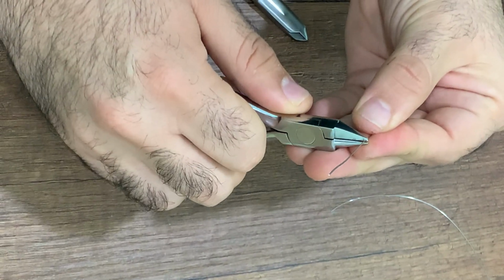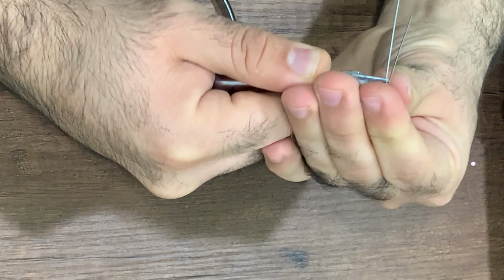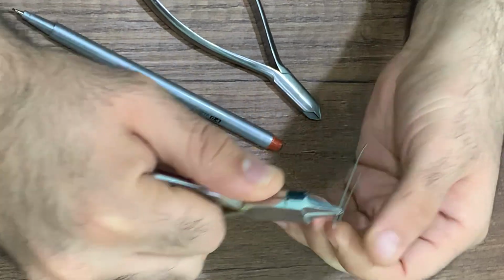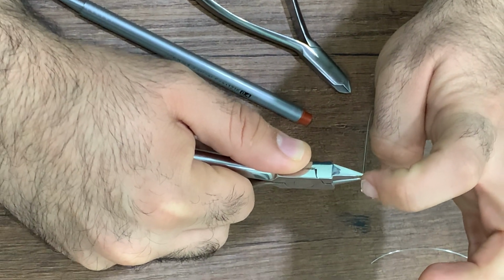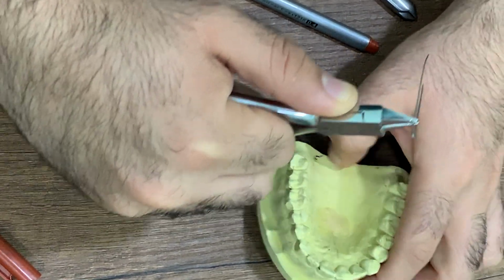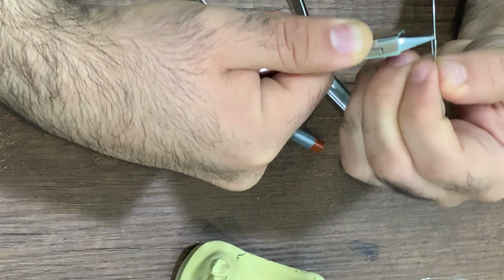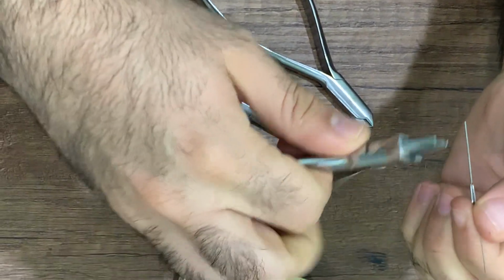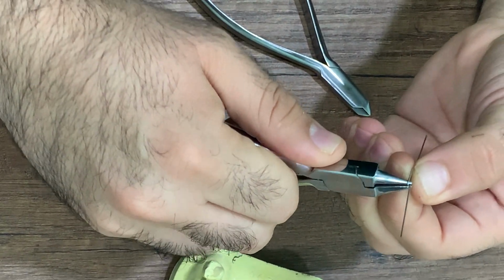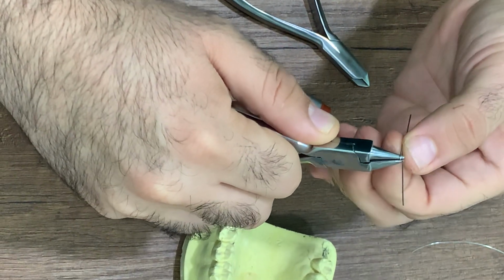Firstly, we start to make the horizontal arm with U-loops. Like this. We select the width of the horizontal arm on the tooth to be moved, like this. And we bend the wire. And the vertical arms start at right angle to the U-loops, like this.